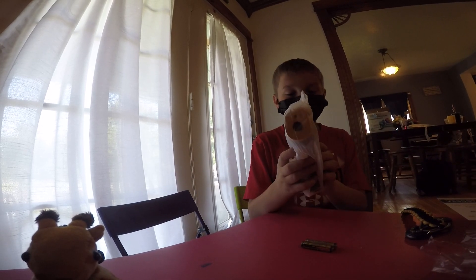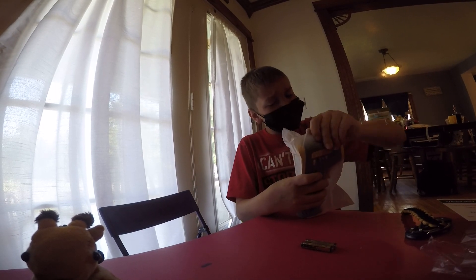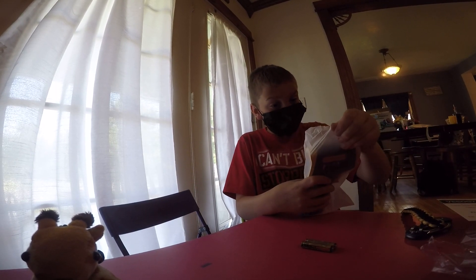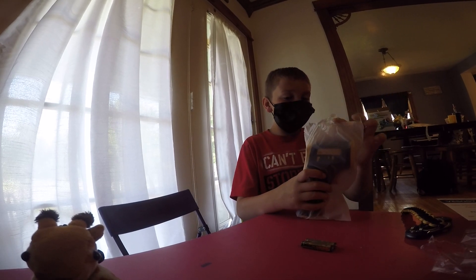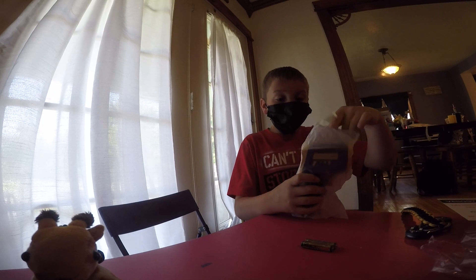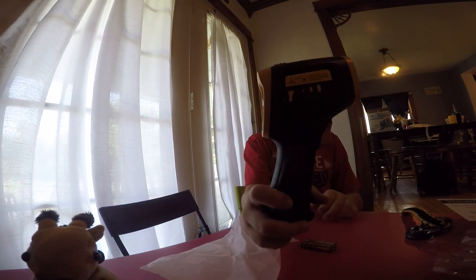So here's the infrared thermometer. Right when you get it, it's packaged very well. Here it is — this is a nice looking device.